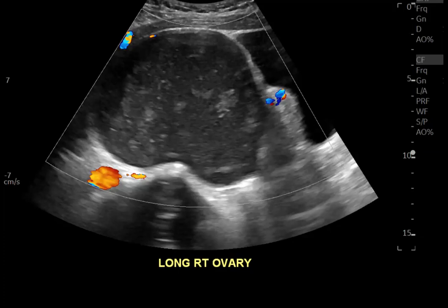Yeah. I do find them to be tricky when you're on the spectrum of possible malignant degeneration, because we've had several now where there's enhancing components to an endometrioma, and then the final path comes back as benign with fibrosis. Yes. So it seems like it's a little tricky. We're not totally specific even with MRI, but you always have to bring it up if you see an enhancing nodule. Completely agree. We had one where they reported polypoid endometriosis on pathology for those enhancing nodules, and one they just said endometriosis. There was no explanation of the enhancing stuff.